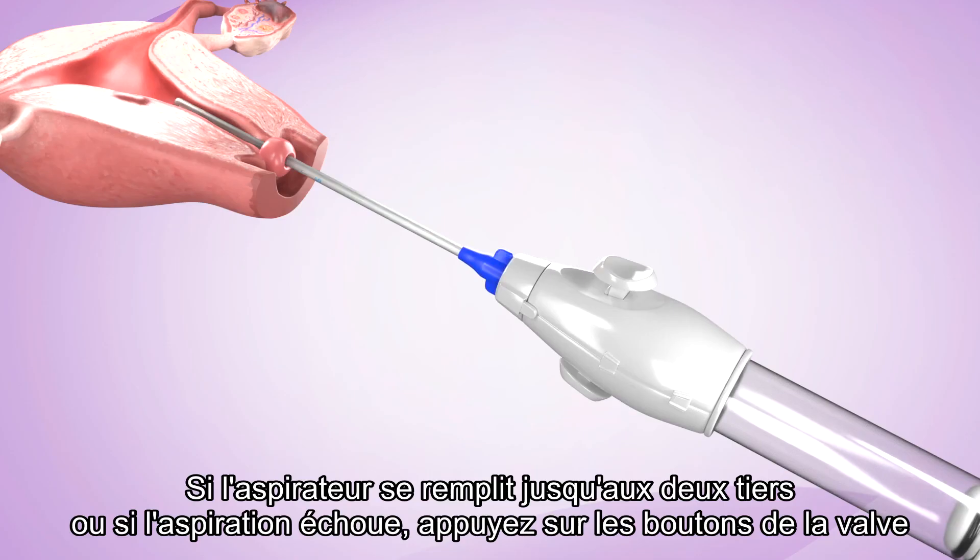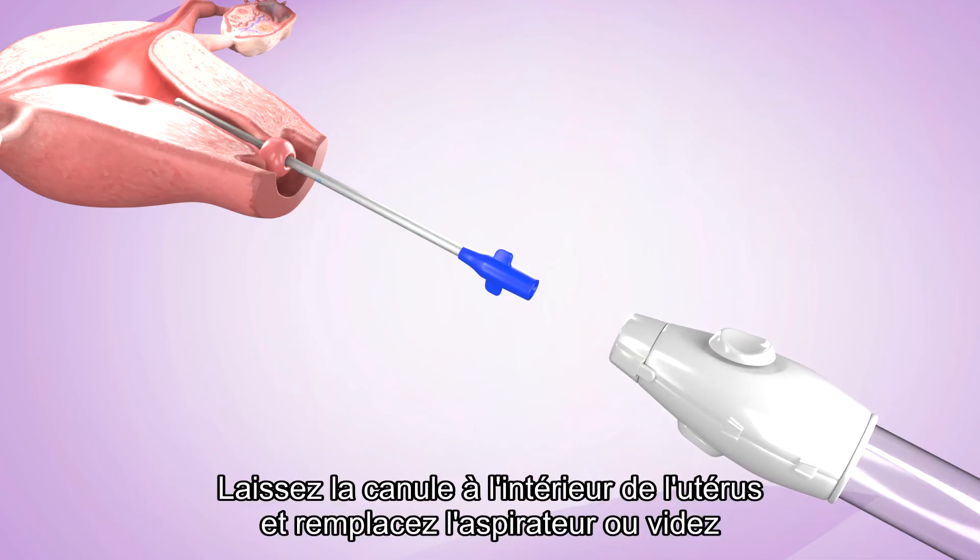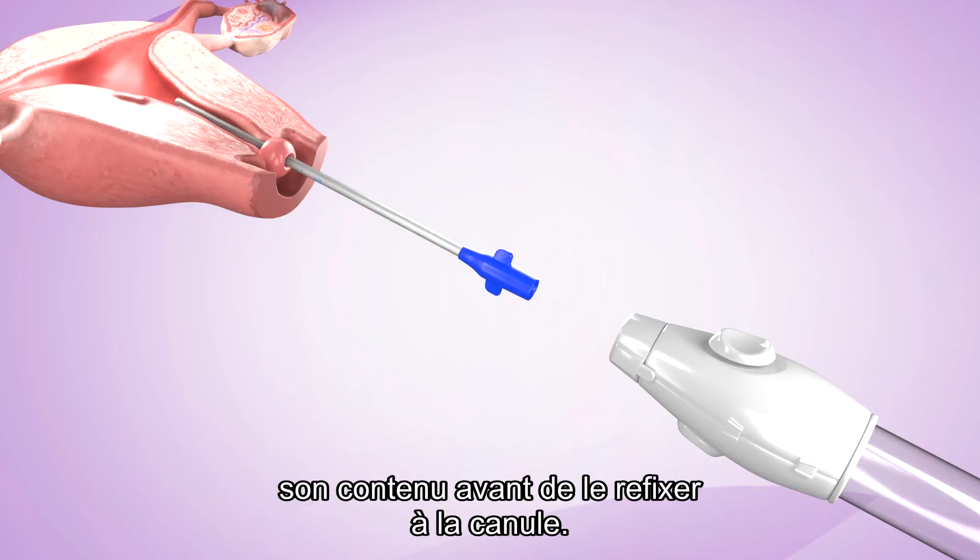If the aspirator fills up to two-thirds or if suction fails, depress the valve buttons and disconnect the cannula from the aspirator. Leave the cannula inside the uterus and either replace the aspirator or empty its contents before reattaching it to the cannula.